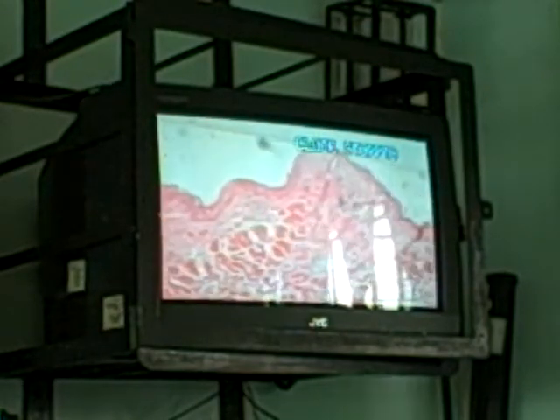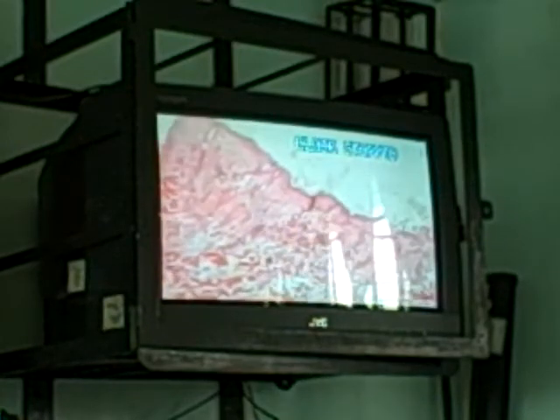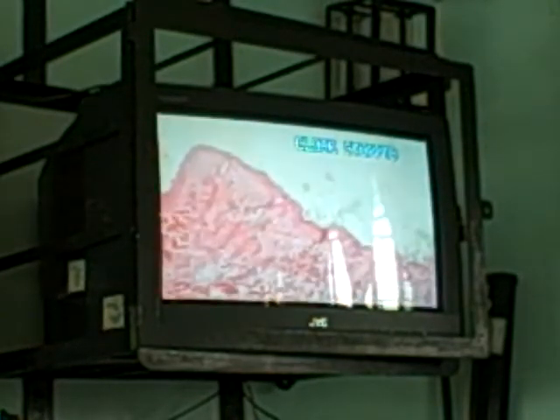Now, if you go on the opposite side, you will notice the invagination, the glands. So these are your hair follicles, so that's your skin or epidermal portion. Okay? And in between is the red border. After that, you have the salivary glands. Next is tongue. I hope you remember the tongue, wherein you have to identify the taste buds.